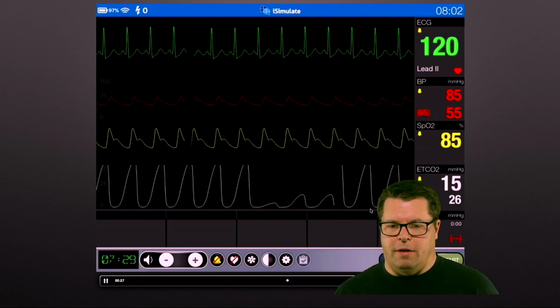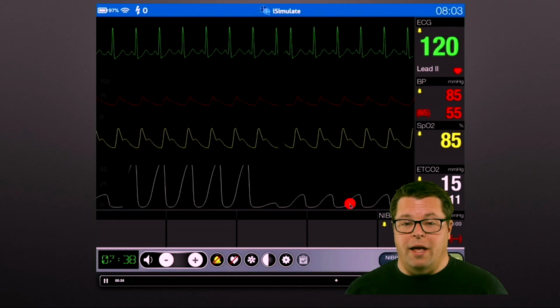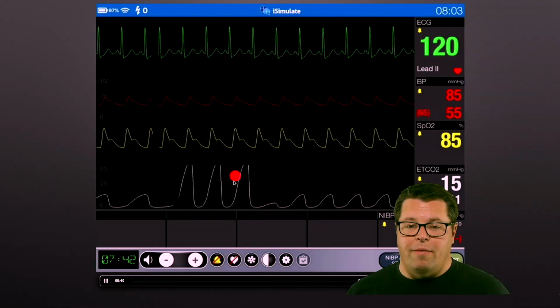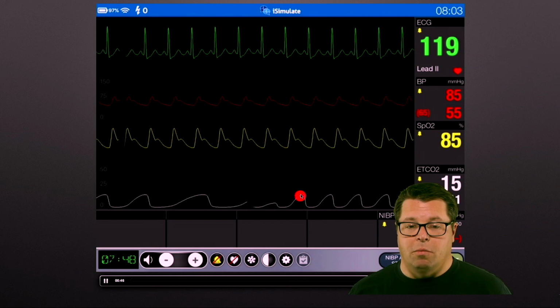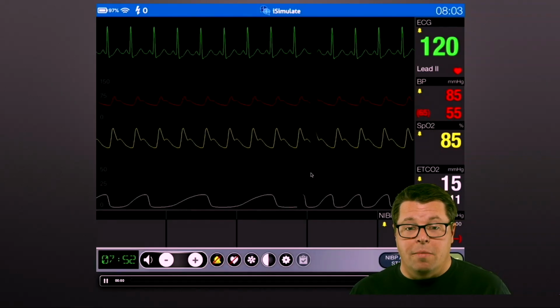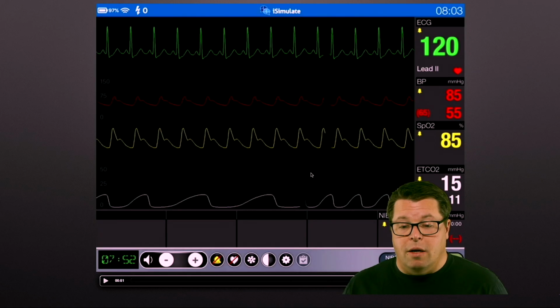unless it really falls off. What could be going on here? Well, now the patient's not exchanging gas anymore. They've gone from really having an obstructive pattern to barely getting any gas out at any time. And now the breathing is getting slower. This is a patient that's tiring out and in imminent respiratory failure. We can again use end tidal CO2 to help figure that out.